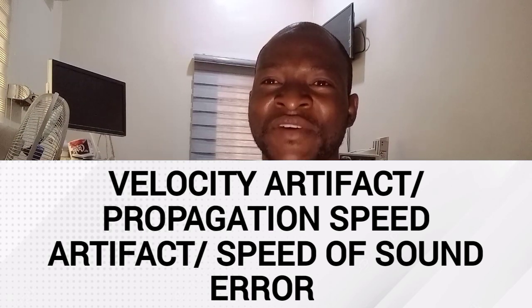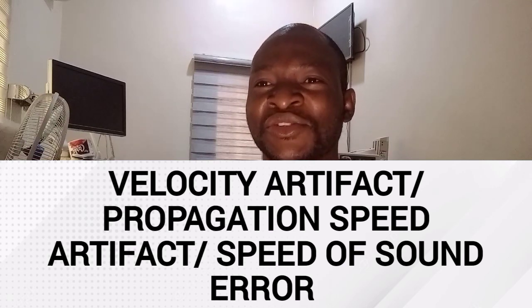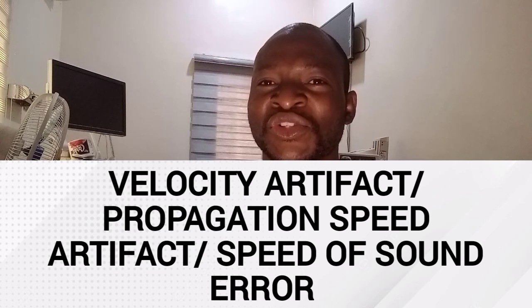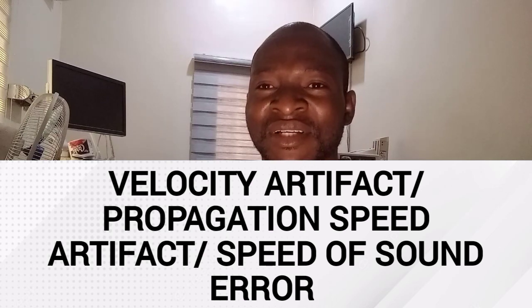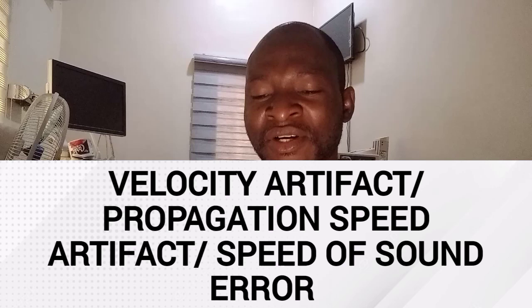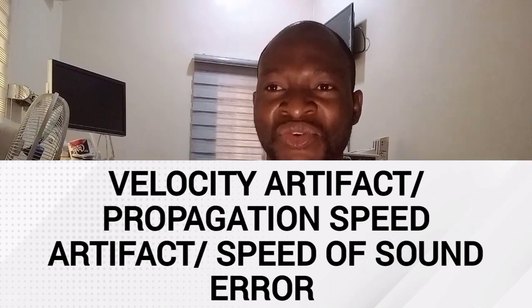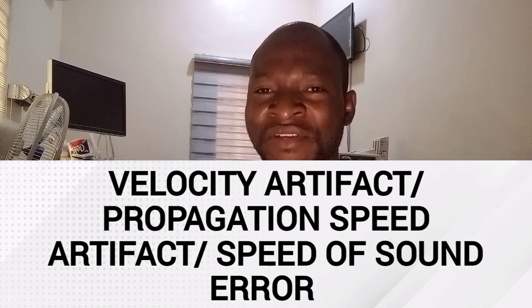Now, velocity artifact, or propagation speed artifact, or speed of sound error, is a type of misregistration error. The ultrasound machine assumes that the sound speed in all soft tissue is constant at about 1,540 meters per second. This is the calibration speed used in the ultrasound system to calculate the distance to any interface or reflector.